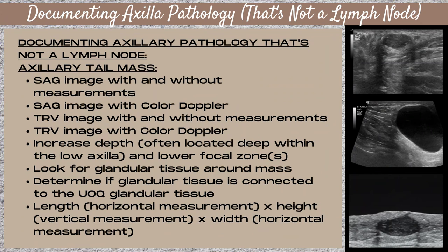To document a mass within the axillary tail tissue: take a sagittal image with and without measurements, a sagittal image with color Doppler, a transverse image with and without measurements, and a transverse image with color Doppler. Since this tissue is located deeper on the ultrasound image below the fat layer, increase your depth and lower your focal zone. Look for glandular tissue around the mass — if it's connected to the skin line it's accessory breast tissue; if it's connected to the upper outer quadrant glandular tissue, it's axillary tail tissue.